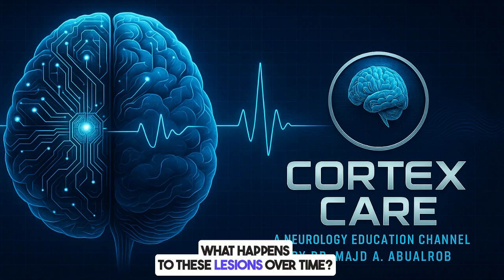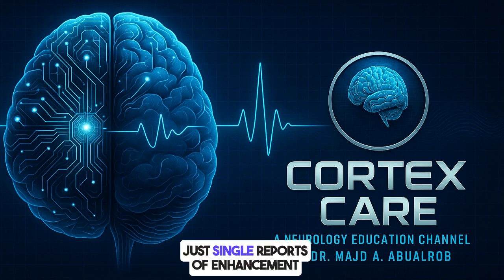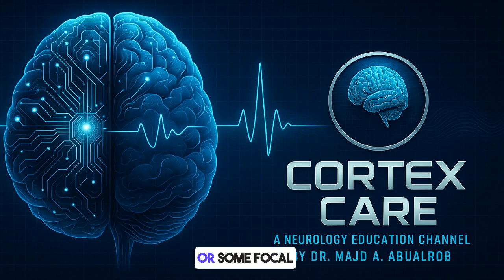What happens to these lesions over time? In many cases, they do resolve. But sometimes generalized atrophy can develop later on. And contrast enhancement? Rare. Just single reports of enhancement in the parietal lobe or some focal leptomeningeal enhancement. Got it. Okay, IgLON5 disease. You said earlier this one has a really diverse clinical picture.